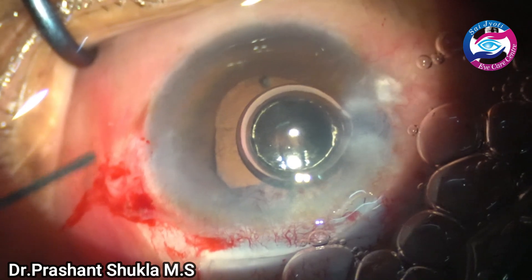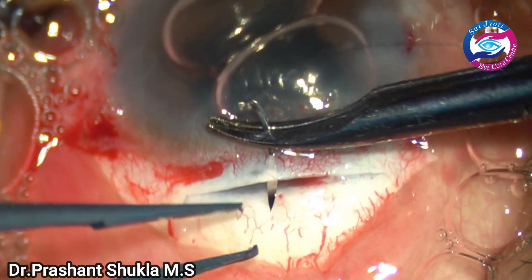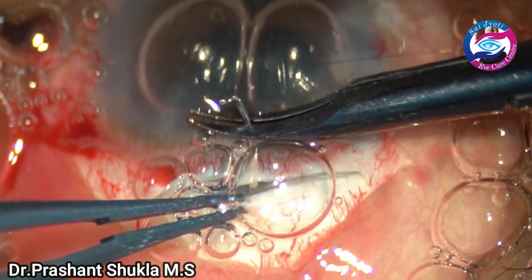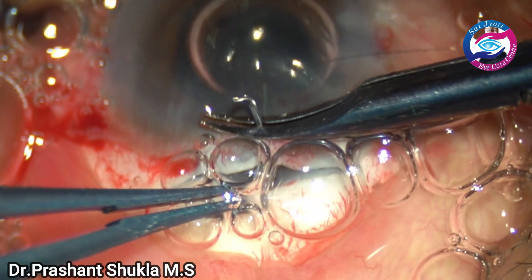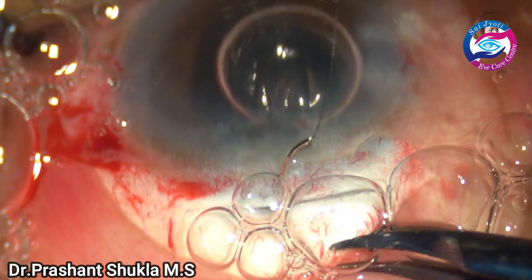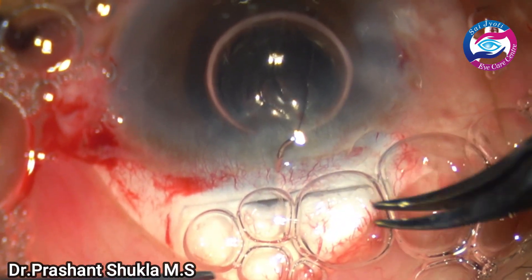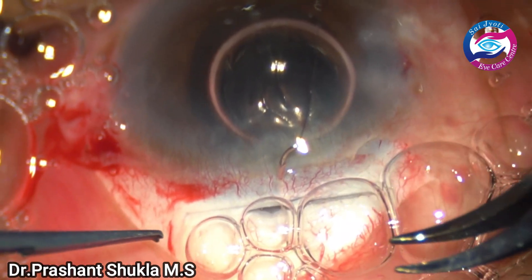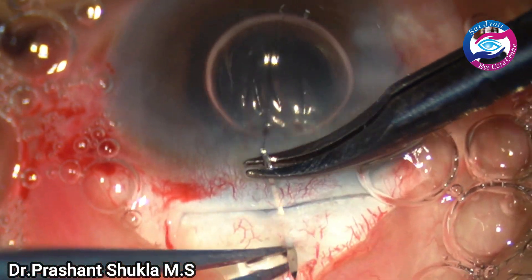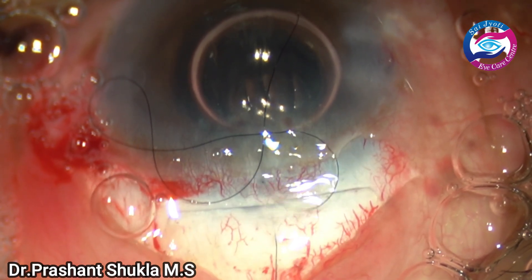Some air bubble is instilled into the anterior chamber. Here I am putting a 10-0 nylon suture to counteract the against-the-rule astigmatism which would have been caused by this large incision. The patient did well — there was a substantial amount of corneal edema the next day but the pressures were normal. The patient did not have any pain. The patient was given post-operative medications and also some anti-glaucoma medications and called after 5 days.